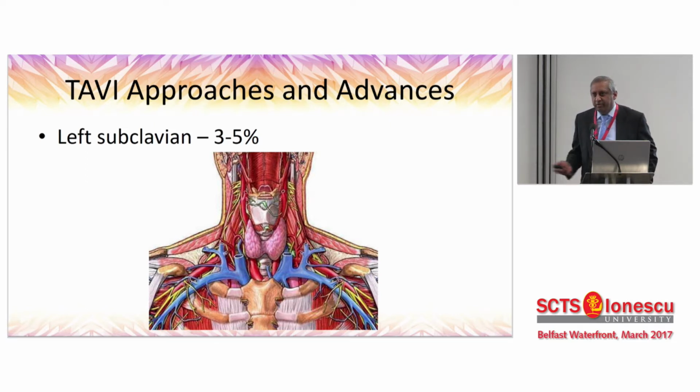Again, here, just like with the femoral, a few provisos. Just be careful about the brachial plexus. They do look like a vessel, and they do transmit pulsation. So if you put your finger on it, you might think it's actually the artery, but it isn't. But so long as you're careful, you can easily access it. Some people use a graft attached to the artery and then deliver the device to the graft. I just go directly through the artery. On one occasion, I've had to patch the access point, but on the other occasions, just a direct surgical closure has worked quite well.